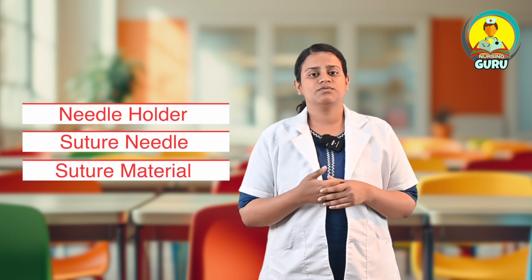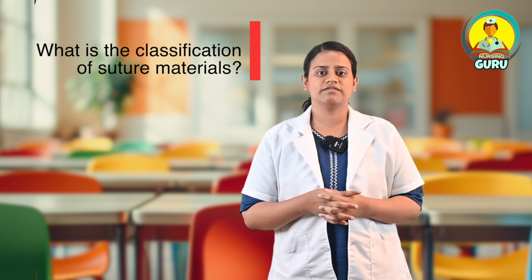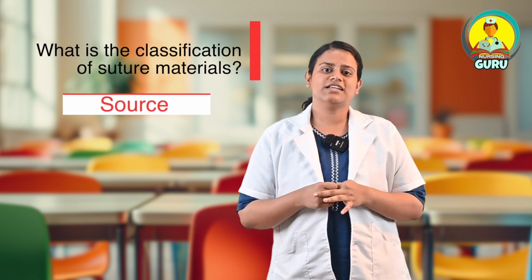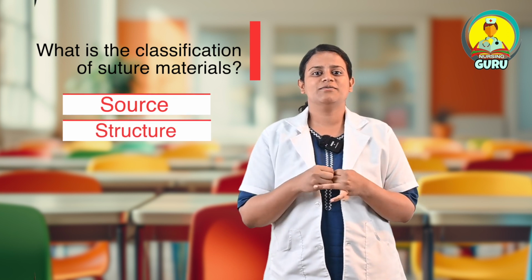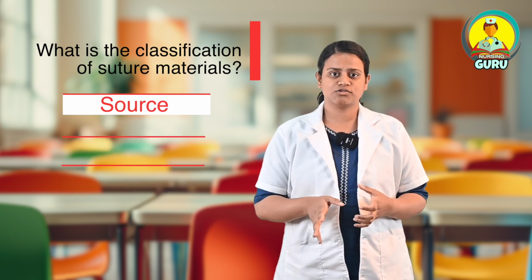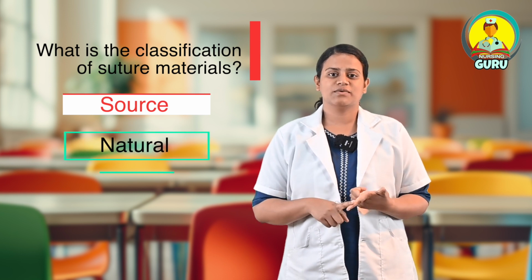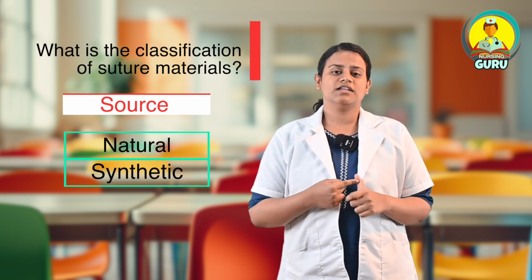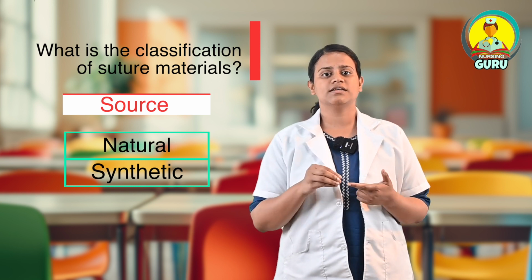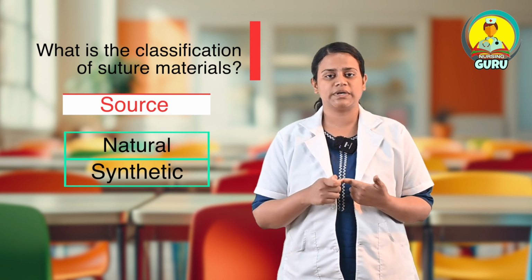After this we will discuss the classification of suture materials. Classification is divided into 4 different types. First, according to the source; second, according to the structure; third, according to the fate; fourth, according to the coating. According to the source, it is again divided into 2 types: one is natural, second one is synthetic. Natural are natural things used to make these suture materials. Synthetic are the artificial fibers that are used to make these suture materials.